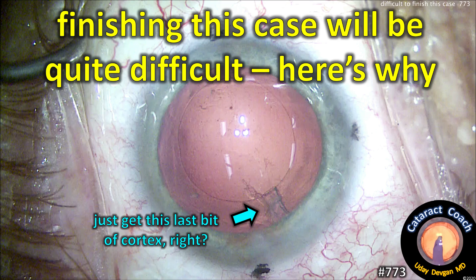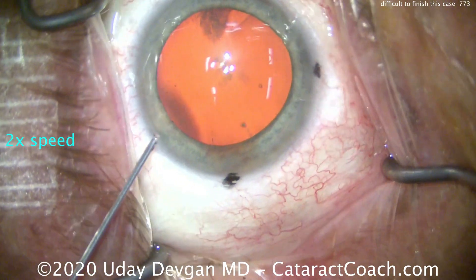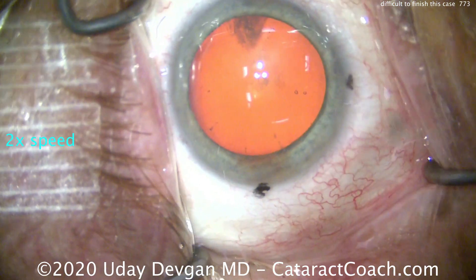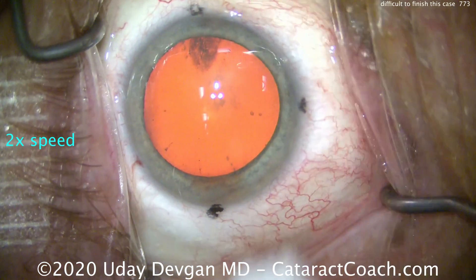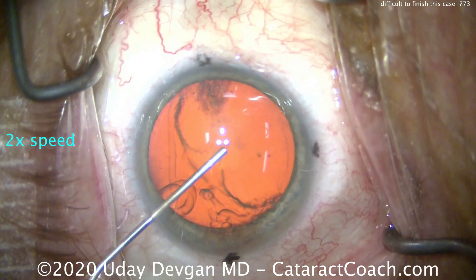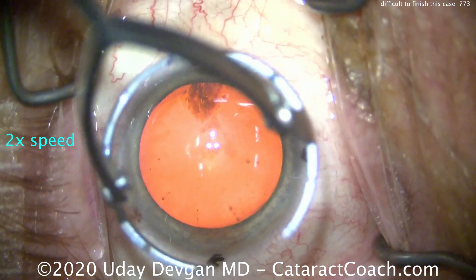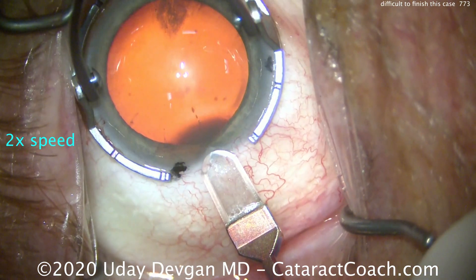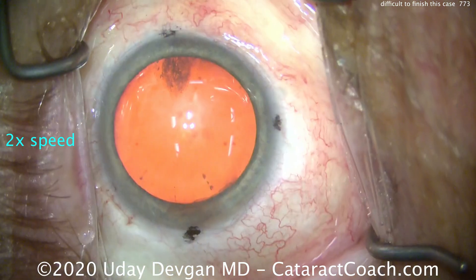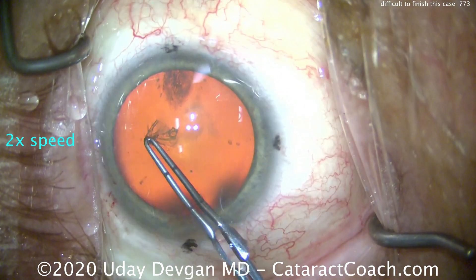You think you'll just get this last bit of cortex, right? We'll speed up the case and do it nice and fast. You can see we've placed marks on the limbus for a toric lens, anesthetic going inside the eye. Everything looks pretty good so far. Filling up the anterior chamber with our dispersive viscoelastic. Still looks good — very routine case. The patient is a little hyperopic with a lot of astigmatism. Placing our phaco incision on the steep axis, and you can see those three dots in the cornea show our steep axis.